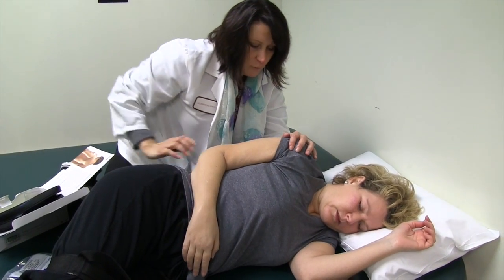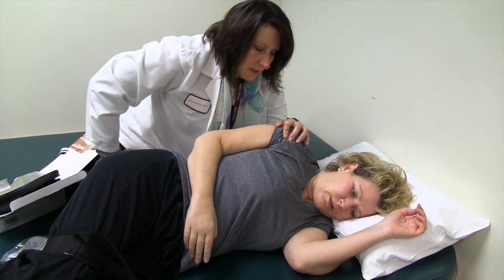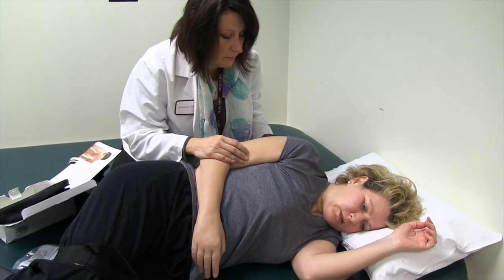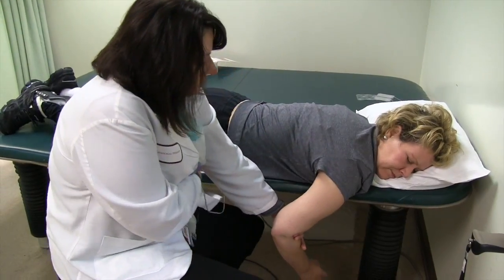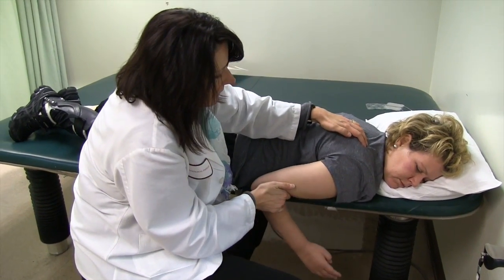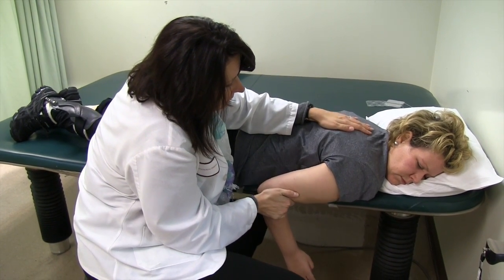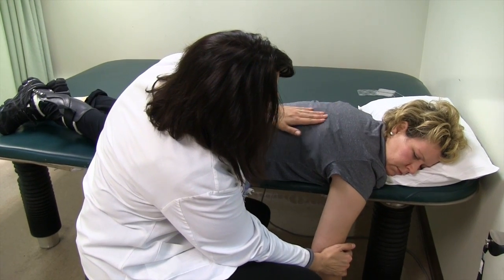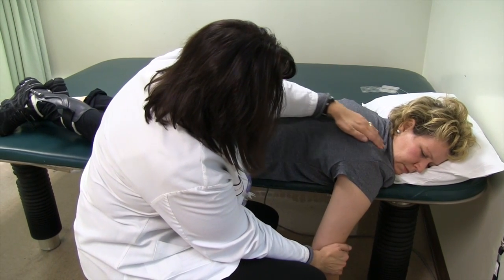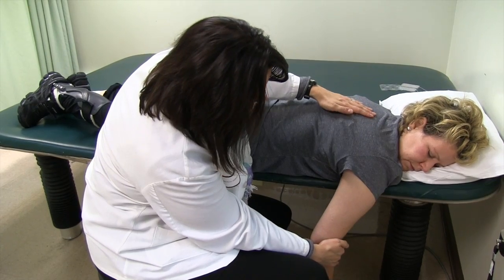Now what we're going to do — now that I have your placement good — I'm going to have you get onto your stomach. I'm going to come around in front and have you do the exercises like you did last week with the arm dangling over the edge where you're having to really fire this muscle. You're going to start with your arm in this position. When you feel the stim, I want you to pull your shoulder blade up and back and pull your arm up to your body. When the stim turns off, you're going to let your arm come back down. I want you to access these muscles right here where the electrodes are. I'm going to guide you through it — when you feel the stim, initiate the movement.